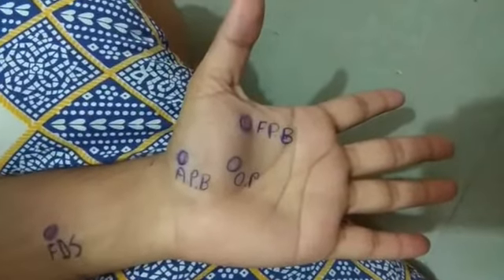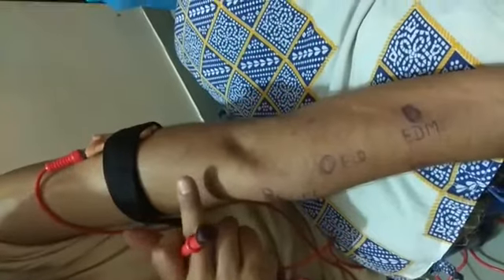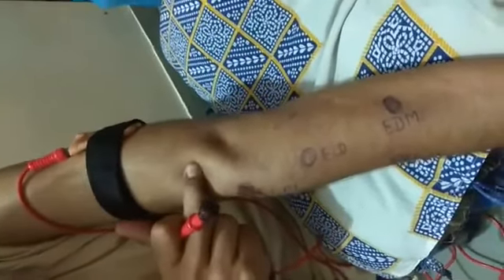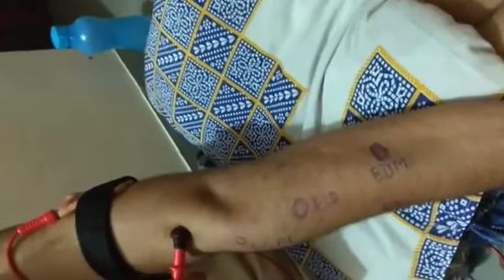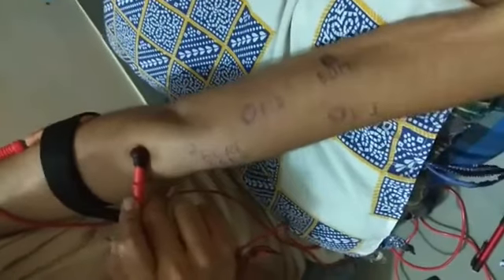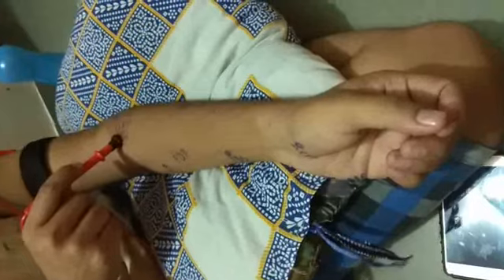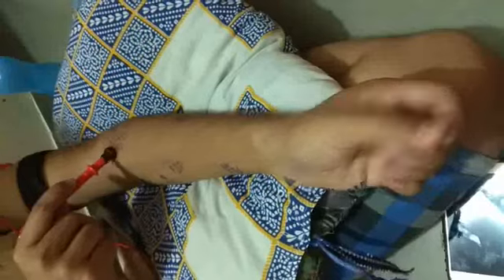This is all three motor points of the thenar eminence. Radial nerve. We can put the reference electrode at the radial groove of the humerus, and/or at the lateral epicondyle of the humerus, behind the lateral epicondyle of the humerus. This is the motor point for the brachioradialis muscle. The action of brachioradialis is elbow flexion.